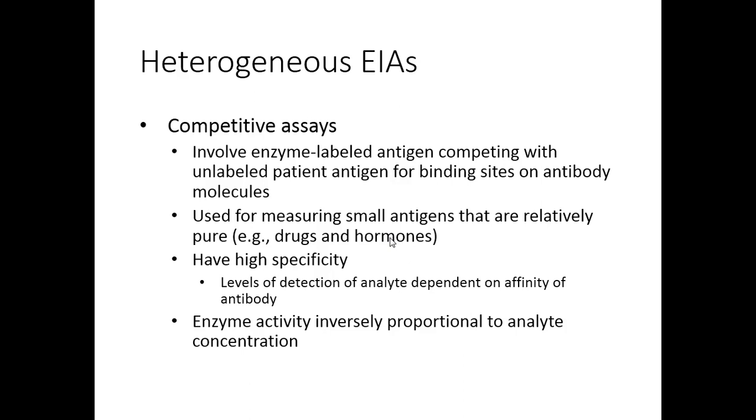What's kind of our reason for using competitive assays? We use them for small antigens, haptens, and we use ones that are relatively pure because we really want to make sure that we don't have things that are cross-reacting. We want things that are really very clear what it is we're looking for. The test methodology allows for a very high degree of specificity. So it's an important test for us to be able to do some of those very specific things like hormones and drug screens. Those things are often small or at very low concentrations, sometimes very hard to detect by other laboratory methods.